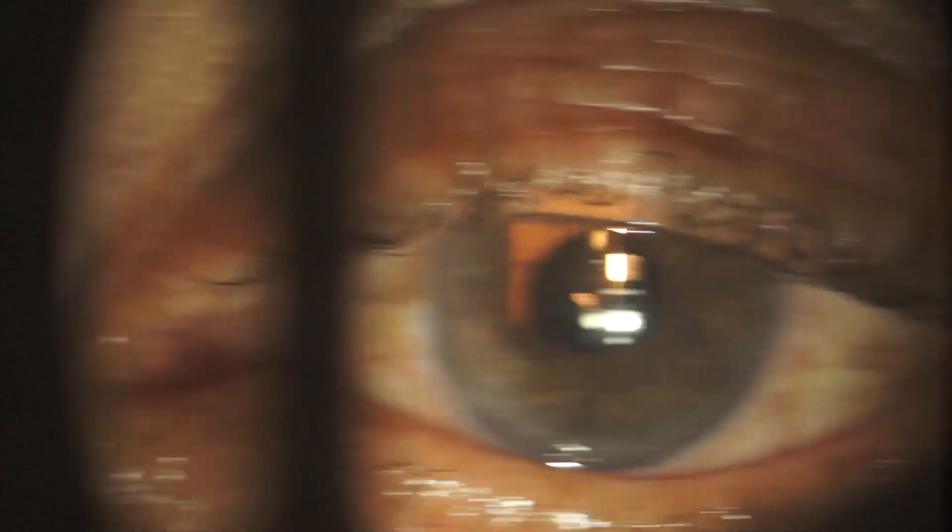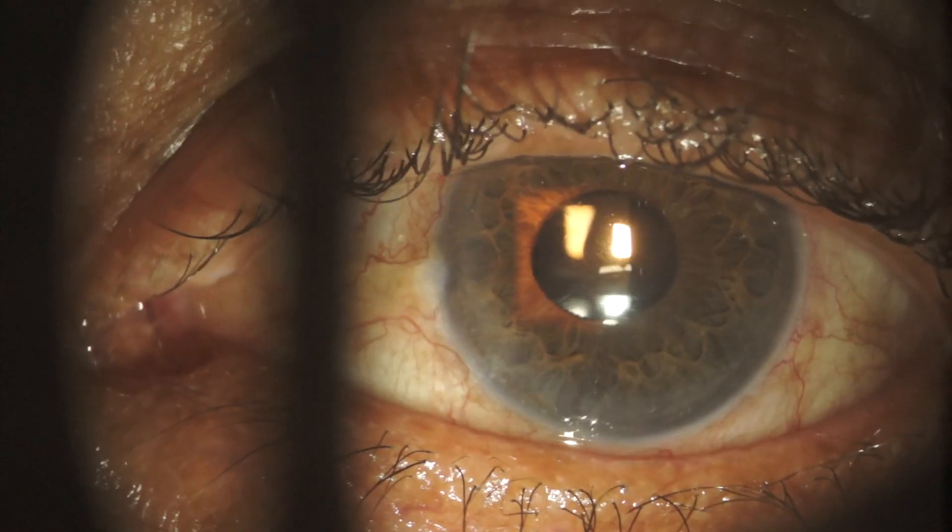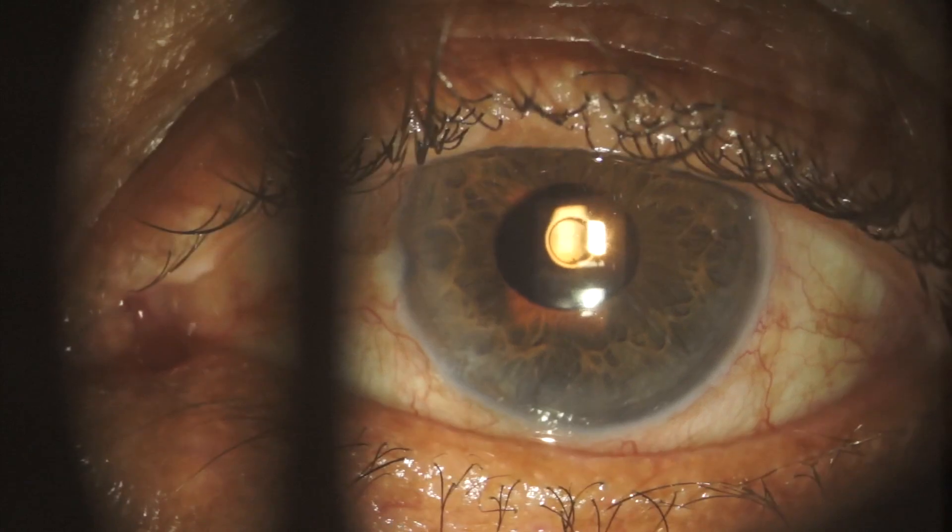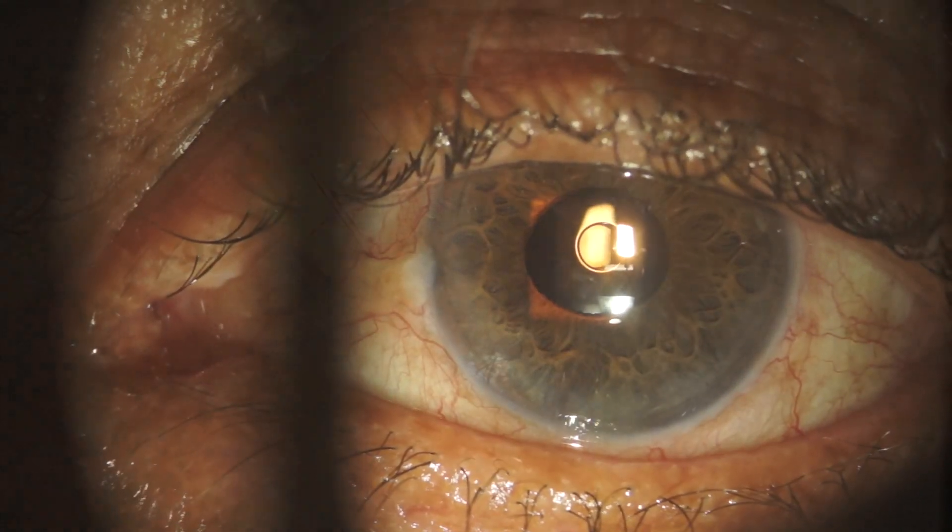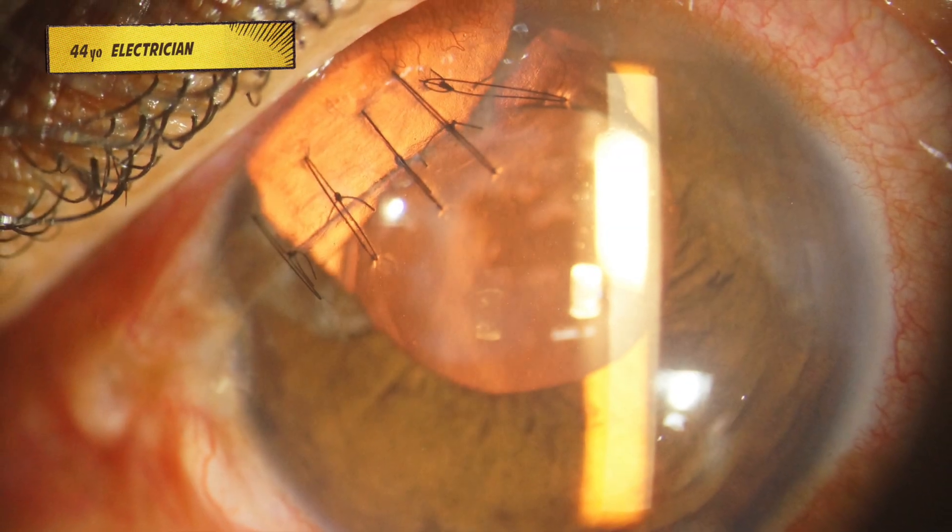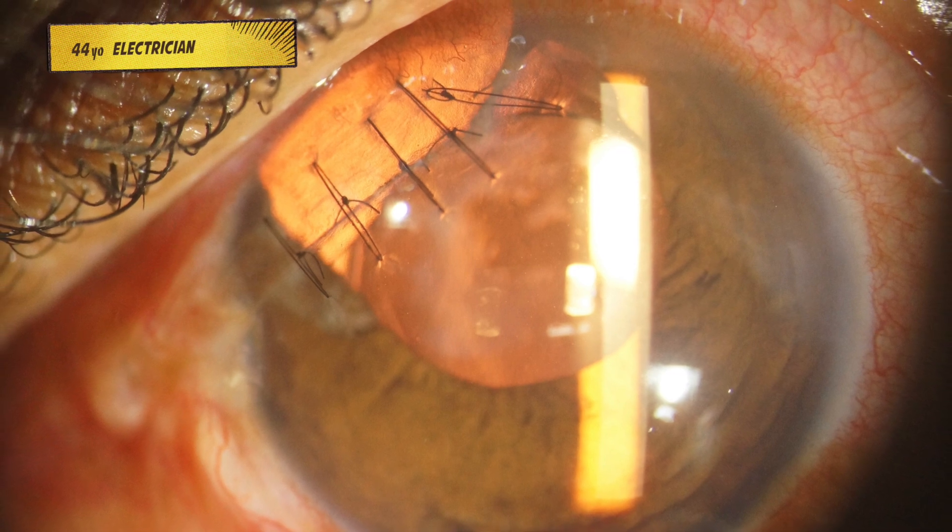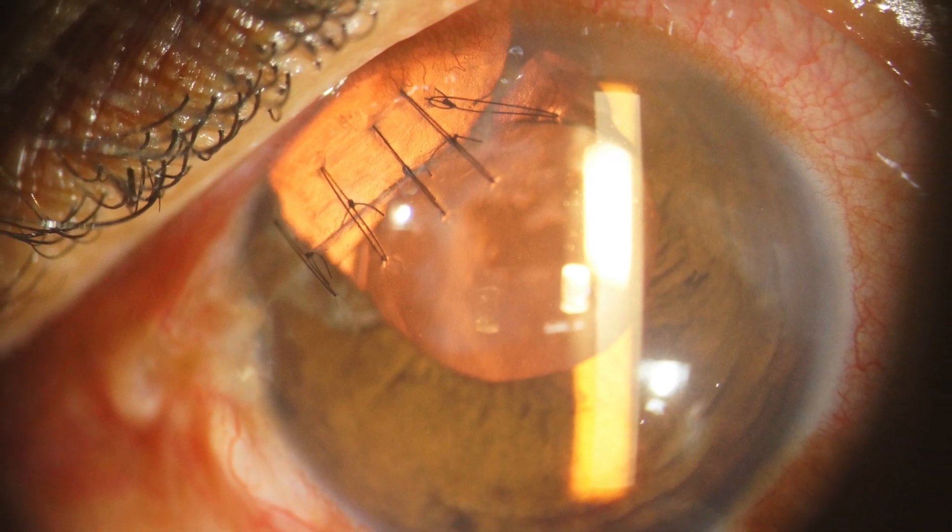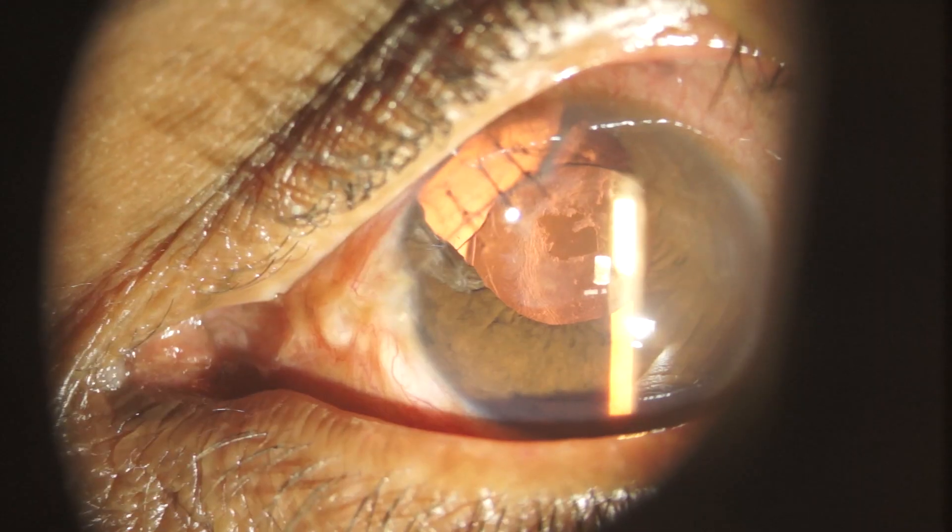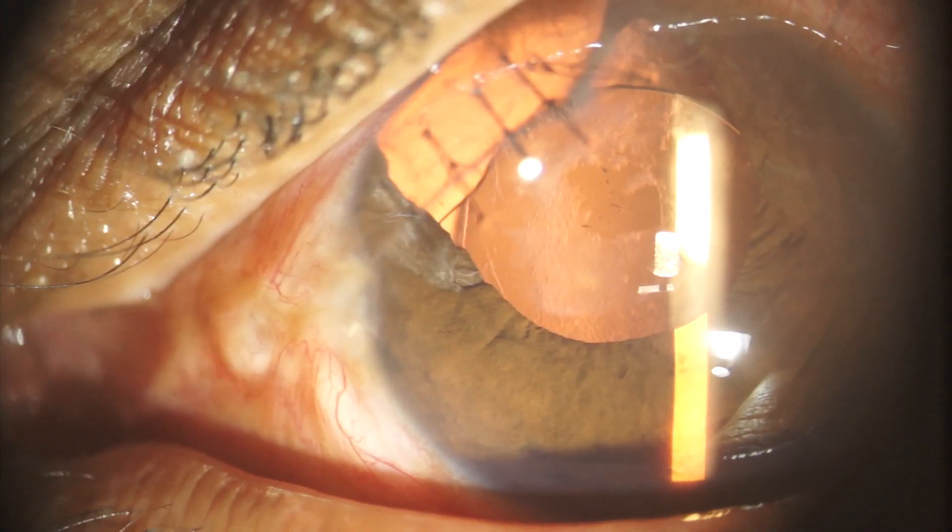Although the device was created for eyes with normal iris, it is especially appropriate for those cases with concurrent iris defect. This patient had a terrible knife accident, with a large corneal laceration and iris loss. He was treated with corneal suturing and cataract surgery.